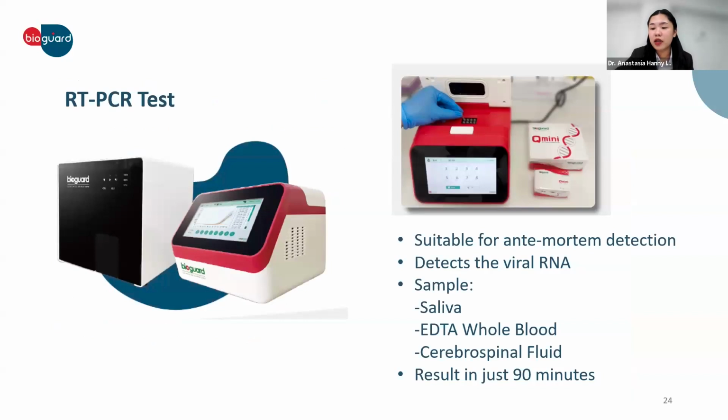The second way is the PCR, the RT-PCR test. This is more suitable for ante-mortem detection, so before the dog is euthanized, because with PCR it detects the virus on a molecular level. It detects the viral RNA of this virus. For the sample, we can use the saliva, EDTA whole blood, or cerebrospinal fluid. Because the virus travels around the body, we suggest to use all 3 samples and test them individually, because we don't know in what stage the animal is. And then we can get the result very quickly, in 90 minutes.